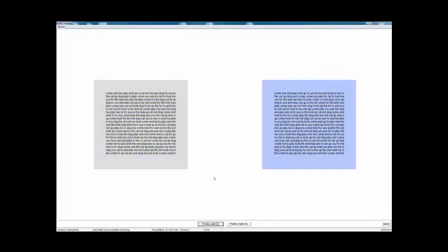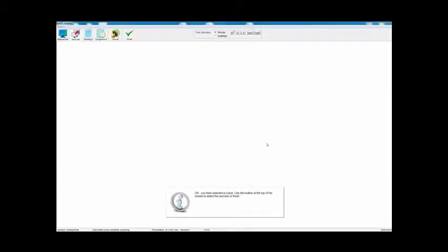I'm doing this obviously very quickly — the patient should take their time and consider each choice carefully. This part normally takes about four or five minutes when it's done properly. At the end of the routine, as a final stage, it compares the preferred color with a gray just as a control, to see if the patient has chosen the color simply because it makes the screen a little bit darker rather than because of the color. I still prefer the blue to the gray, so that's the end of that test. All that tells you is that the patient prefers the blue to the white.